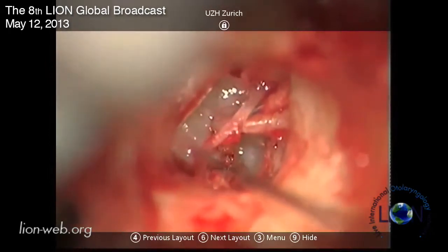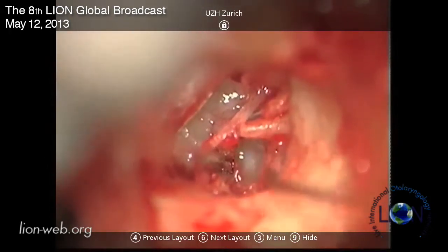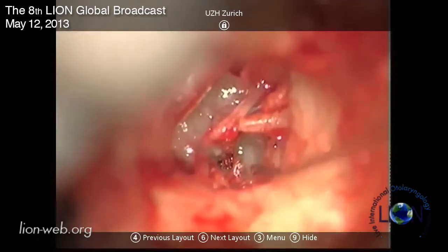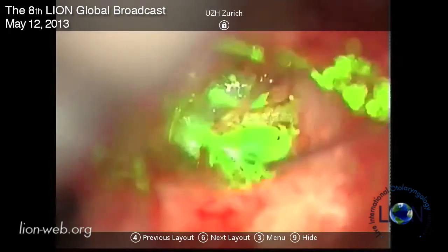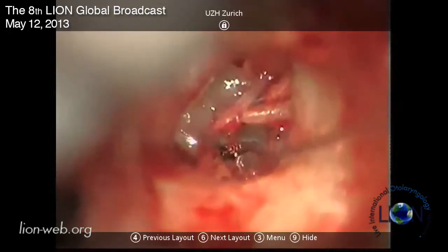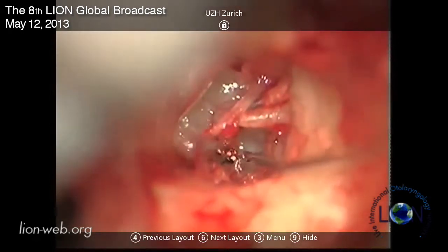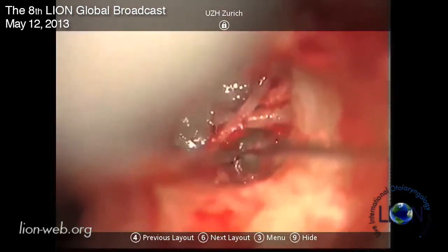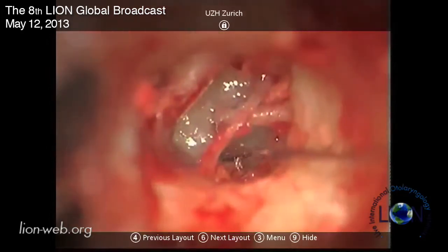It stops the bleeding actually. So I also cut the posterior crus with the laser. What's your power setting on your diode laser? The good thing is it also stops the bleeding. It's now on 2 watts, 0.1 second, which makes it 200 millijoules.